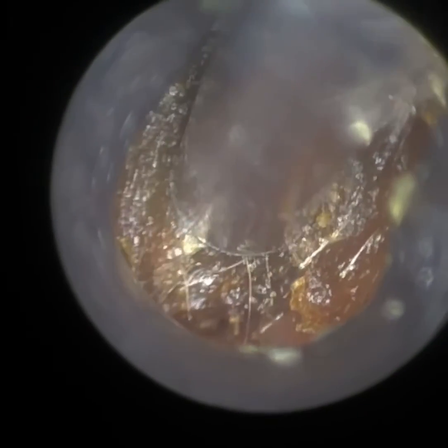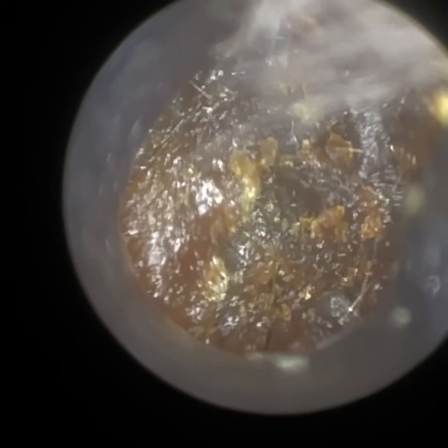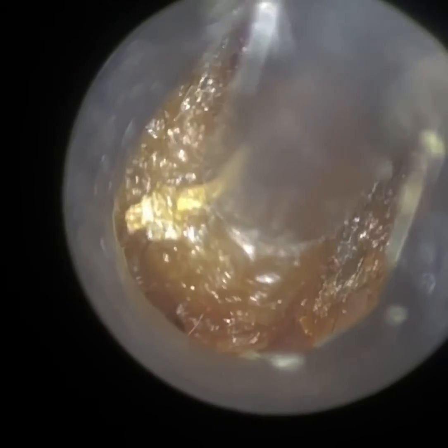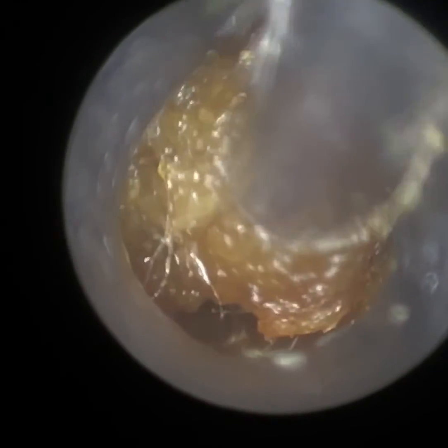You can see it just blocked my suction probe there, so I've just tried to unblock it. I'm just going to get a suction grip. The key is to try and detach it from the canal wall. I can feel the resistance at the base of the ear canal, so I'm just lifting it up and away — a lot of movements. It's just blocked the suction probe again. Just aiming for the floor of the ear canal — probably at the second bend, about two centimeters in, just where the cartilaginous portion and the bony part of the ear canal adjoin. You can probably just see at six o'clock the annulus region of the eardrum coming into view.